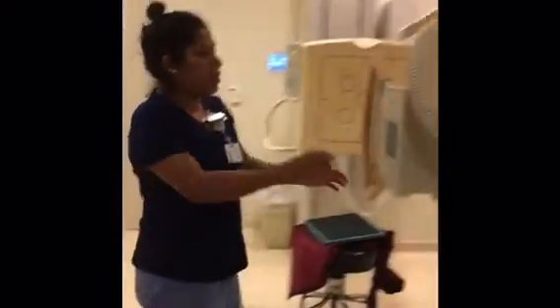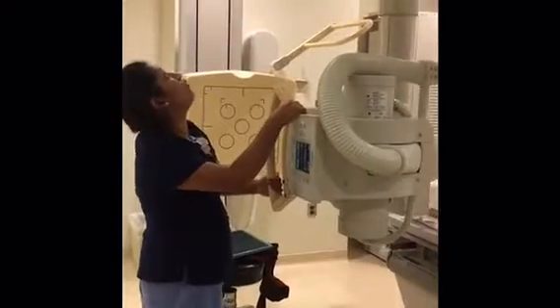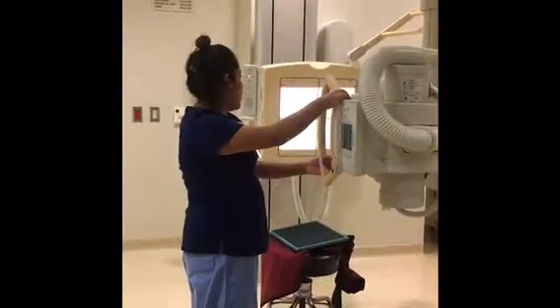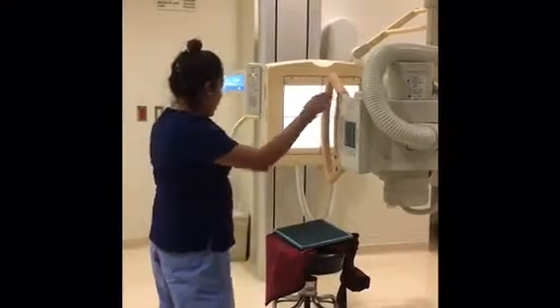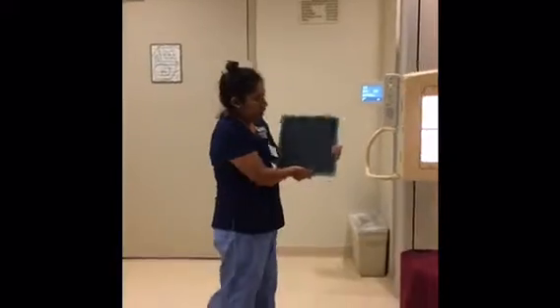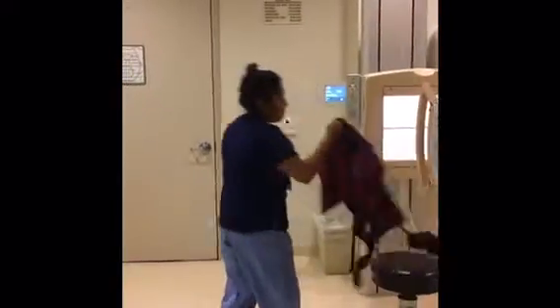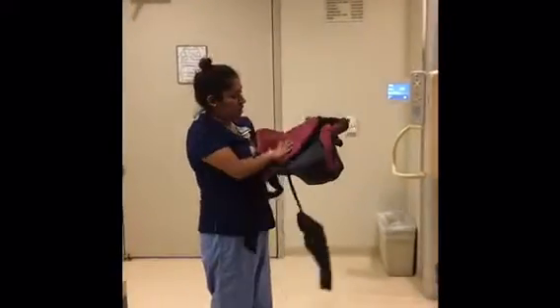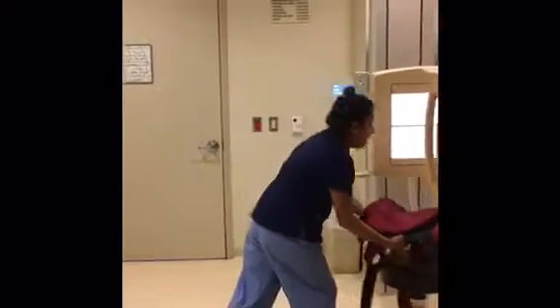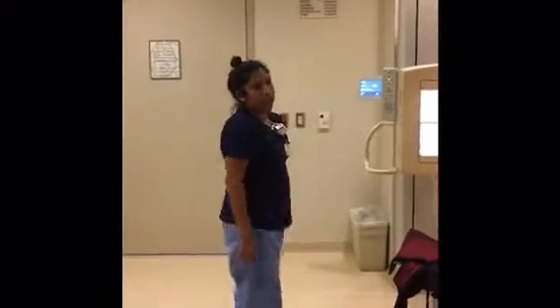So we're going to come here to the tube and we're going to detent this to 40 inches. So we detented it to 40 inches. And now we're going to make sure that we have our IR, and then that we have our shield, and then we have our stool for the patient right there. So now that we have everything ready, we are going to go and get our patient. Okay, now that our room is all set up, we are ready to look at the patient.